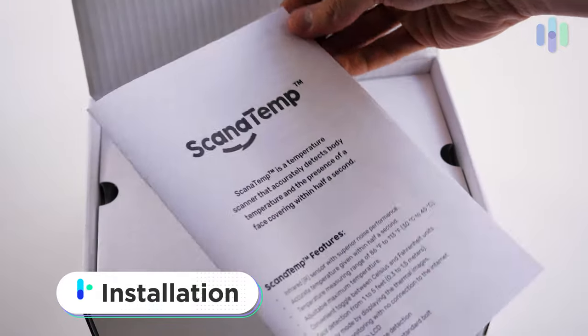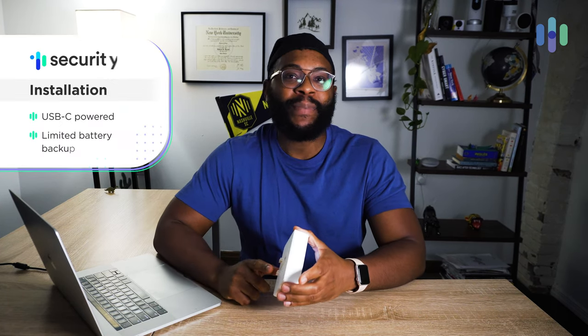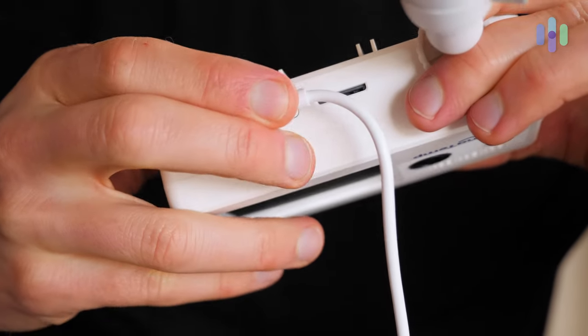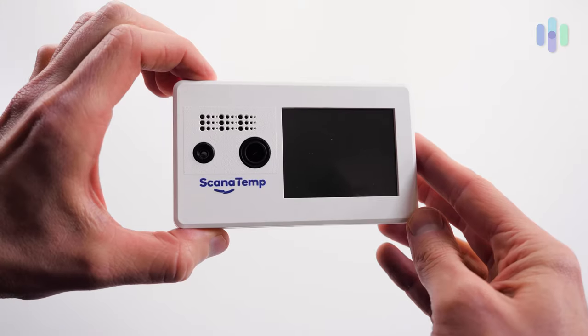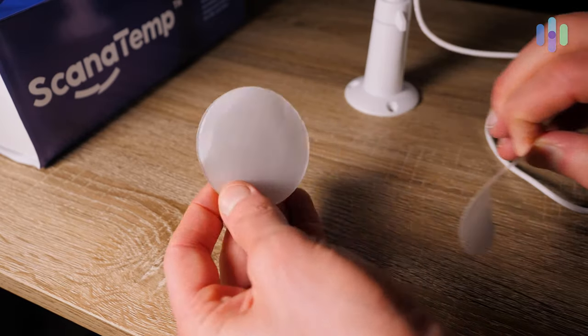What does it take to get your Scan-a-Temp up and running? Fortunately, this is a very easy process. You basically just have one USB-C power port, and you can plug in the AC power adapter it comes with. As you can see from the fact that I'm wildly waving this device around with no wire attached, it does have battery backup. In a pinch, you will not be without the ability to check people for masks and high temperatures. When it comes to placing it somewhere, you can use the mounting hardware it comes with or the adhesive they also provide.